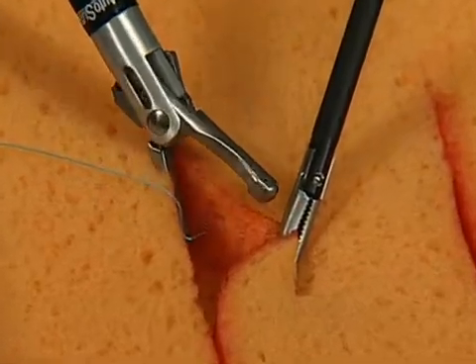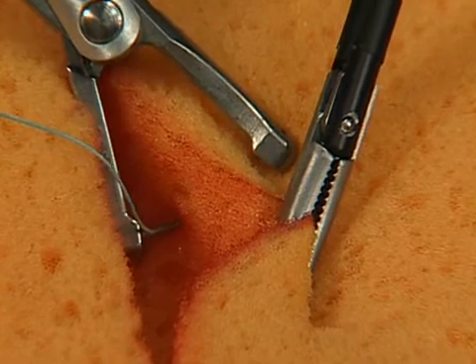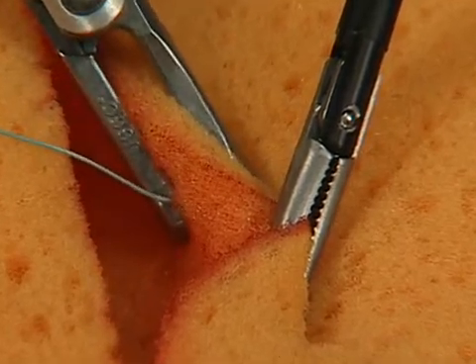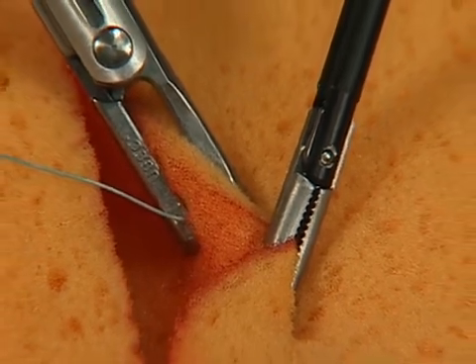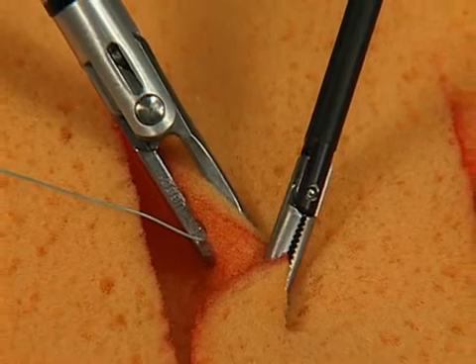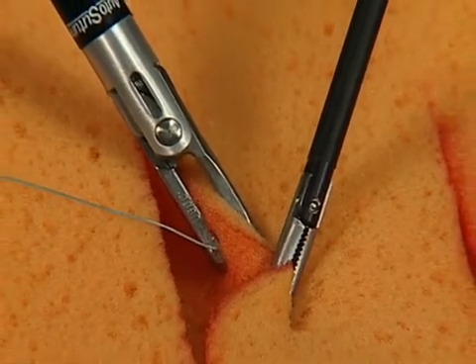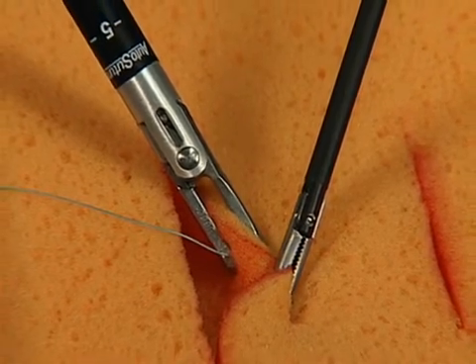To guide the needle through the tissue, close the jaws by completely squeezing the handles and reversing the position of the toggle levers until they stop. Note: toggles may only be activated when the handles and jaws are in a closed position. Failure to do so may damage the instrument. The needle has now been passed to the opposite jaw of the EndoStitch device.